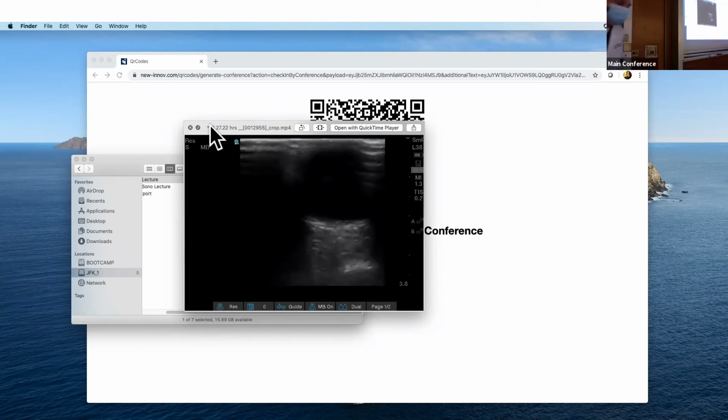With this case, I wouldn't have had that finding otherwise. It definitely prompted them to take this headache seriously as something atypical from the patient's history of chronic headaches. We talk about trying to get a gold standard for looking at something like intracranial hypertension. These things can be helpful when other more common things fail. They had sedated her, they couldn't get the LP, they couldn't get an opening pressure. There are lots of obstacles that step in the way of more common ways of making the diagnosis. But based off this, they spoke to Peds Neuro and got her admitted, and they believed the image was enough to start treatment for intracranial hypertension.